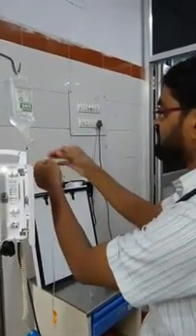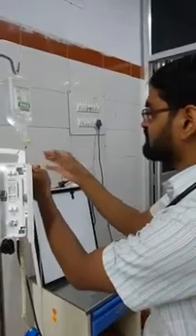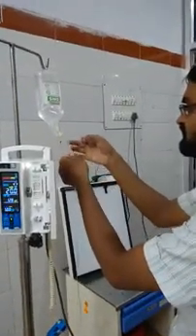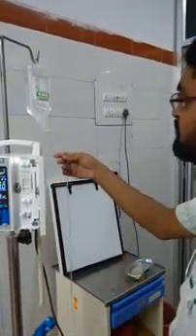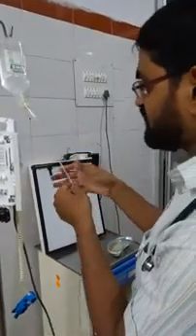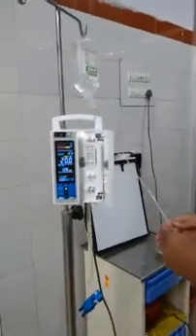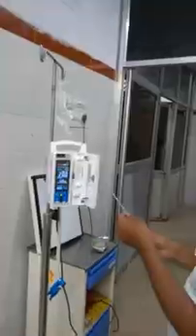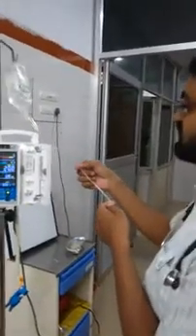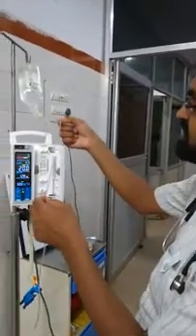Okay, so in my case, that is being done. Fine. Now almost I am free of air bubbles. After that, we can now see that all the micro drops that were there are being cleared up.